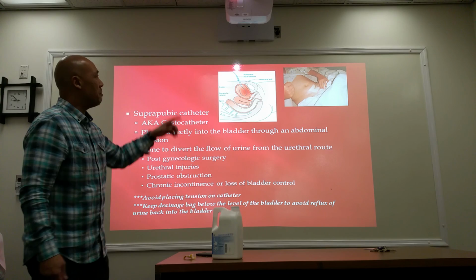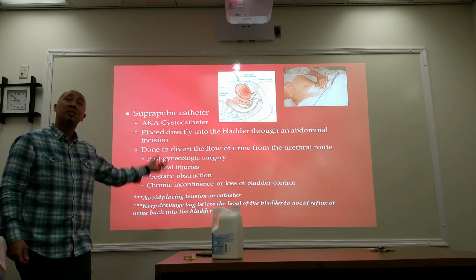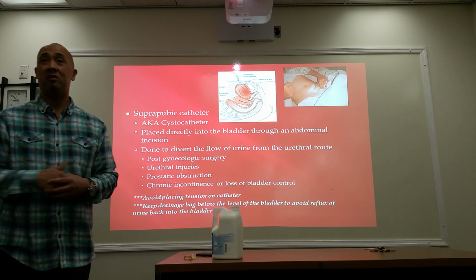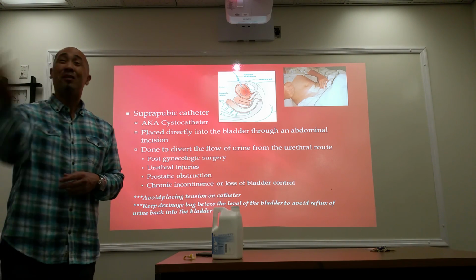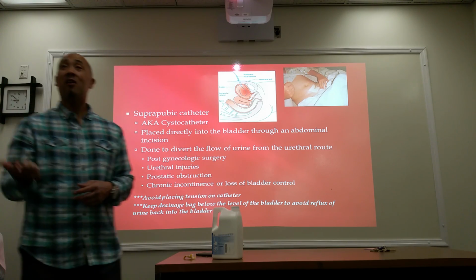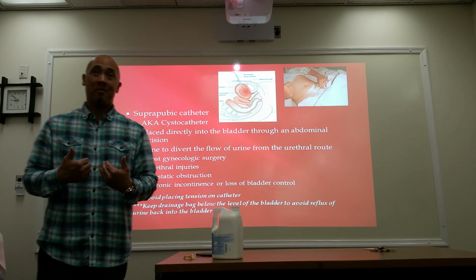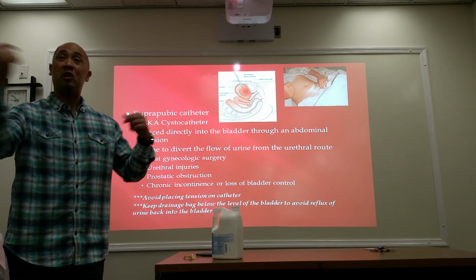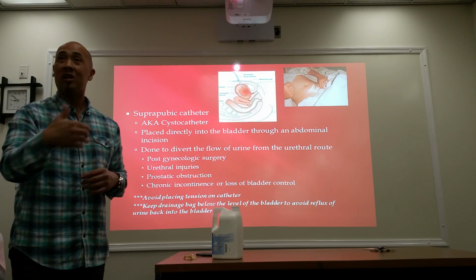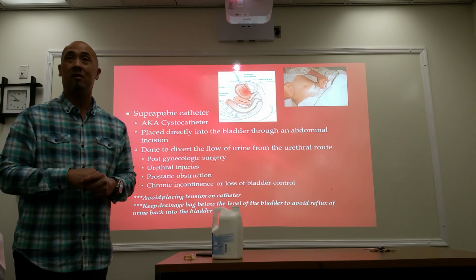Now, because it is considered an indwelling catheter, just like the previous ones we were talking about, there are good chances of infection. We talked about this in the first and second week. The longer a catheter dwells inside the patient's body and communicates with the outside world, the greater the chance of those creepy crawlies crawling up that catheter and into your body, causing an infection.